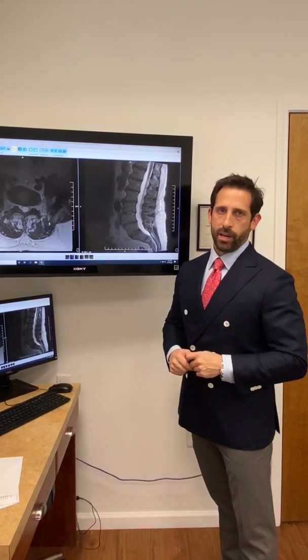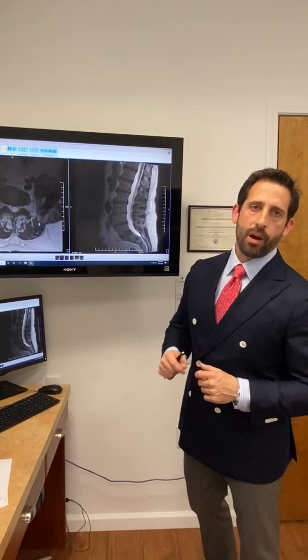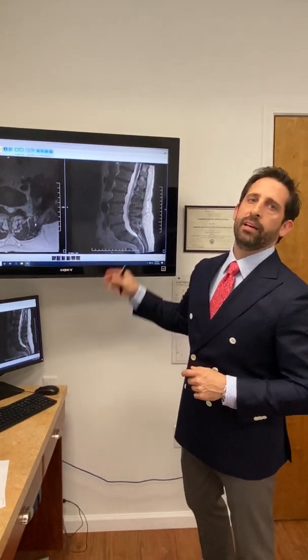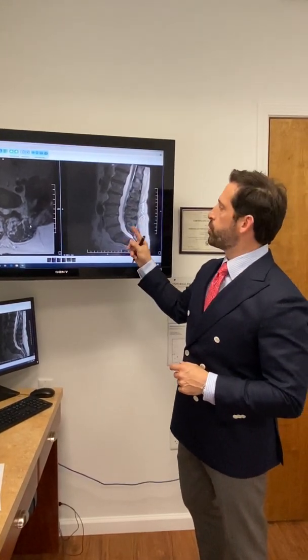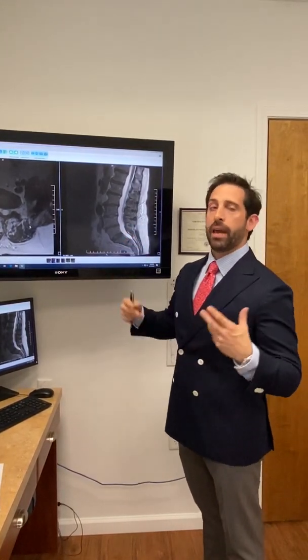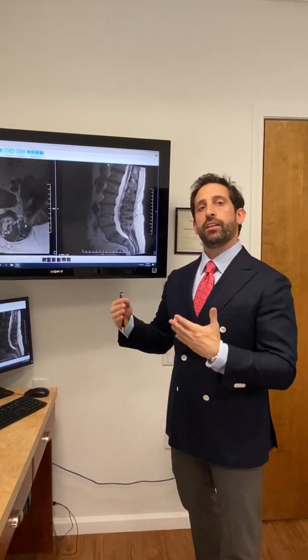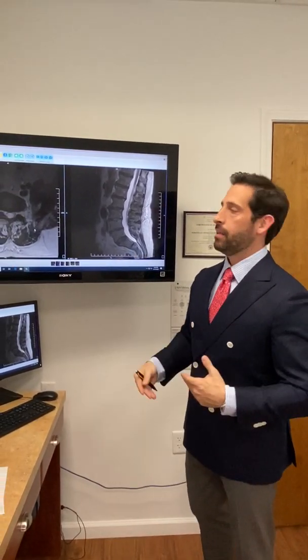Good morning, Dr. Lambrou here, going to get into a lumbar spine MRI with you, explain what we're looking at and talk about what treatment options certain individuals may have who suffer with lumbar spine degenerative disc disease.